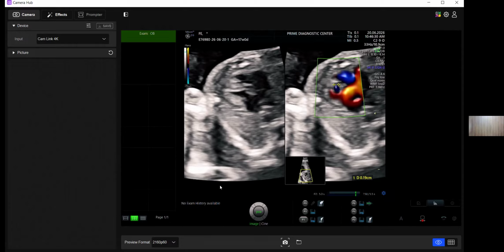Wherever your screen marker is, the marker tells you this is the side which your marker is showing. So whichever side is your marker, the probe mark also should go on that side. If you have to rotate it like this, you keep it on that side. Okay, and if it comes on this side, then your image is getting inverse. So it should not cross the 90 degrees on the other side. I will discuss that. Maybe that's a very unique question. I didn't think about it, but let me formulate an answer for that.